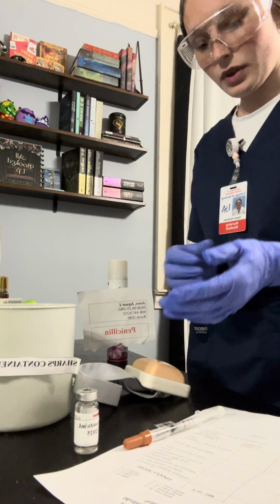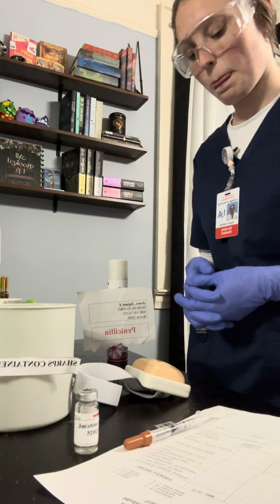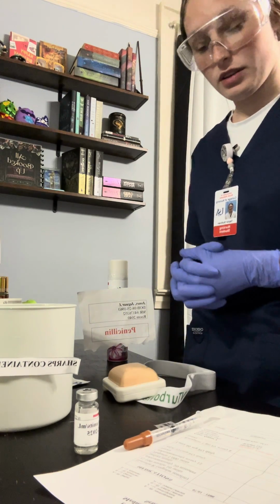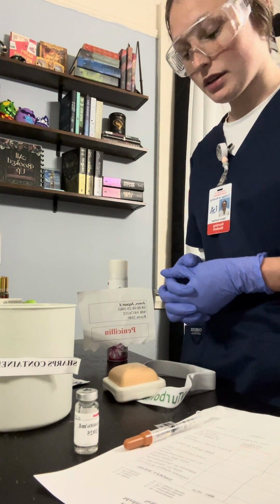So now, before I would inject my patient, I would pre-assess him. Since this is a subcutaneous injection, I am going to be doing it in the abdomen.